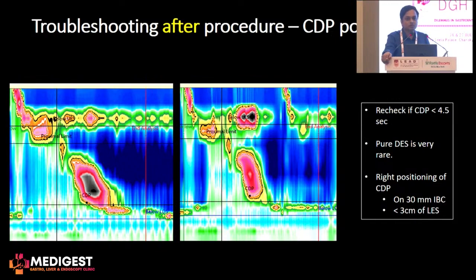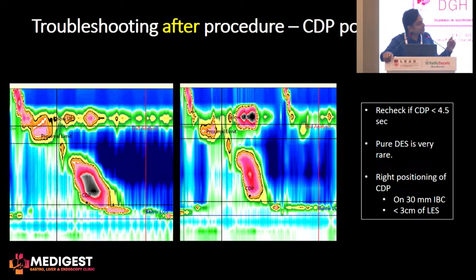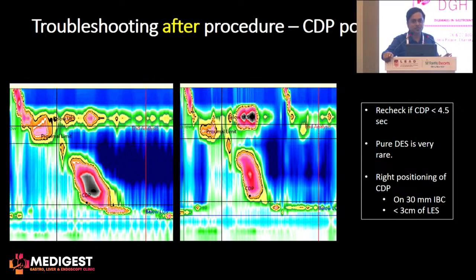Positioning of the contractile deceleration point (CDP) is again very important. If the distal latency appears less than 4.5 seconds, bear in mind that a very low distal latency is extremely uncommon as an isolated disorder. When you see a low distal latency, make sure you have placed the CDP correctly. The CDP must be set on the isobaric contour of 30 mmHg and is almost always within 3 centimeters of the lower esophageal sphincter.